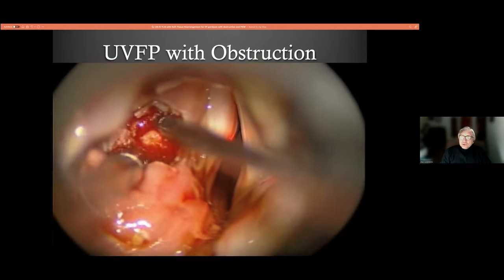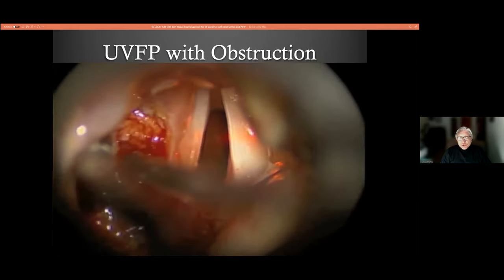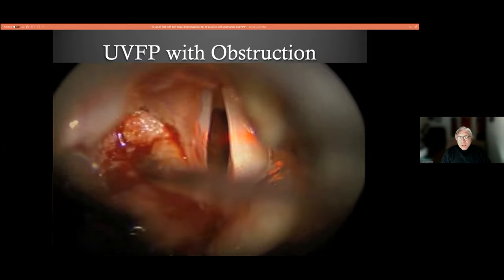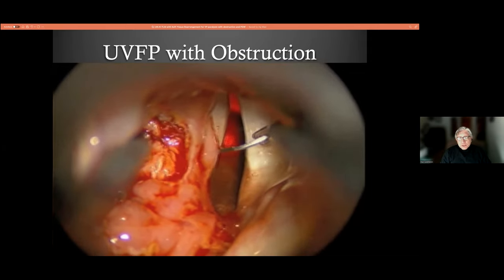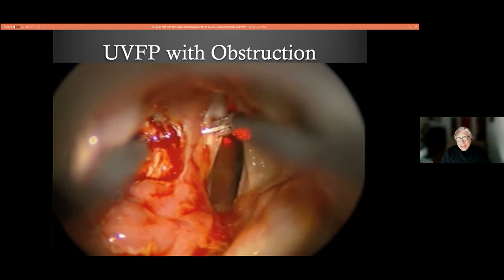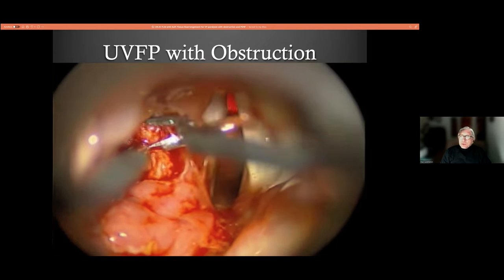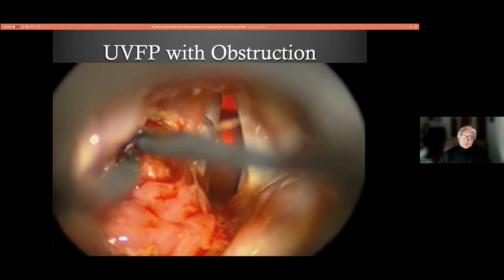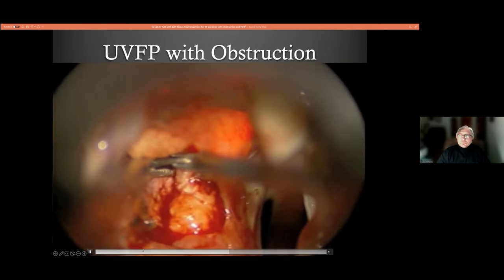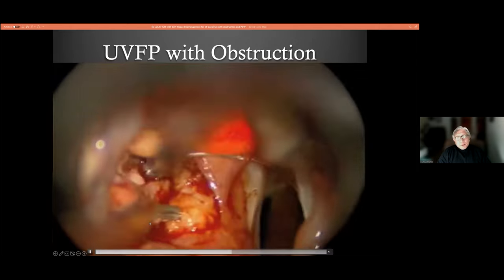And it's being pushed into a muscular bed, which is arguably one of the most ideal places to bring tissue that is devitalized because it will quickly pick up a blood supply. Now you can see how close to symmetrical the cords are beginning to look. You also can see in the position of the arytenoid and the aryepiglottic fold will now be out of the way as well, so that it's giving us both the improved breathing and the improved voice.